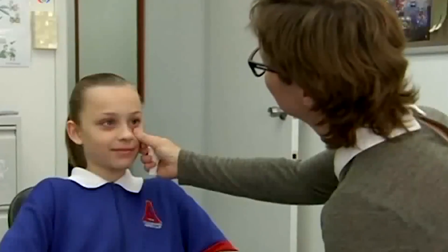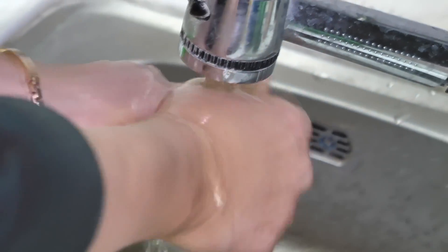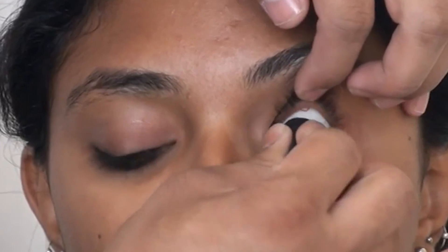Before the patient leaves the ocularist's office, they receive comprehensive education on how to care for and maintain their artificial eye. This includes proper cleaning techniques, hygiene practices, and instructions for handling the prosthesis. The patient is also advised to schedule regular follow-up appointments with the ocularist to monitor the fit and condition of the artificial eye.